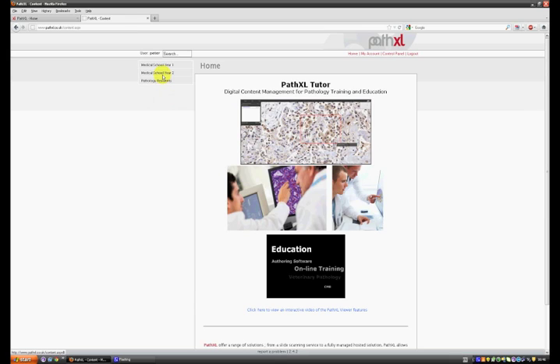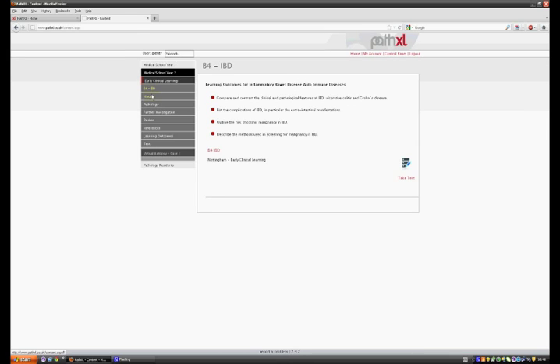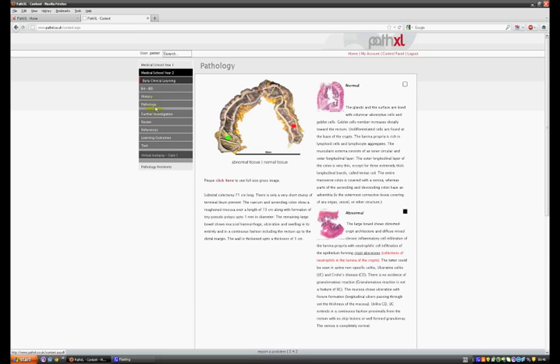PathXL Tutor is not just for viewing digital slides, but gives you a comprehensive environment for managing all sorts of multimedia and educational content, and presenting these in new and exciting ways. Here we see an example of how one medical school is using PathXL Tutor to teach histology and pathology.